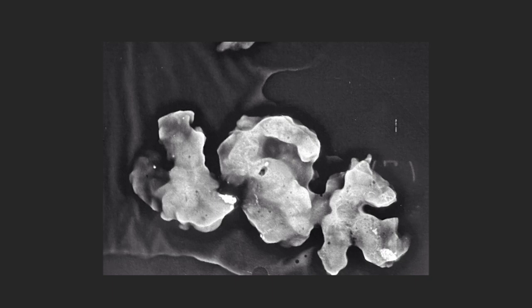And ta-da! Another completely successful biopsy, tons and tons of calcifications in my chicken breast, and no trauma to the patient. Hope that helps. Happy to answer any questions.